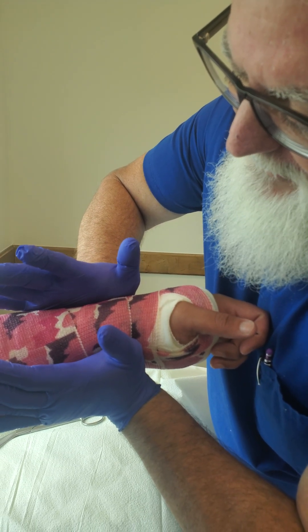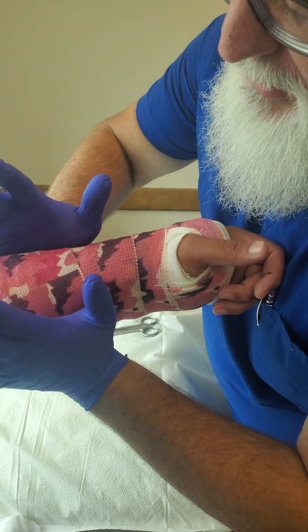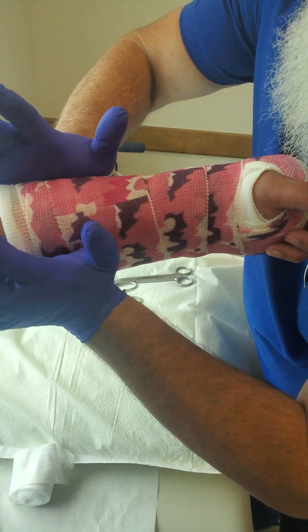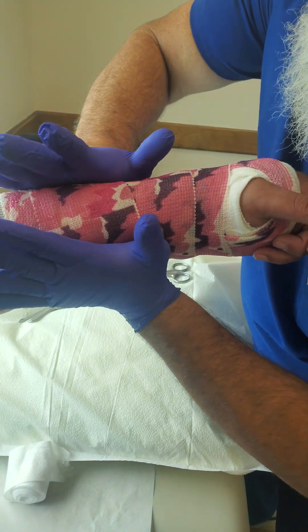There's very little left to do here because it's already setting up, but by doing this mold you're taking away that pistoning effect as well. And that is how you do a nice interosseous mold.